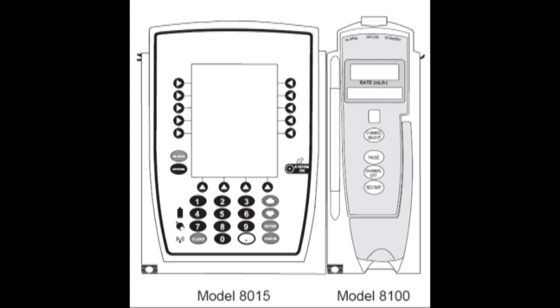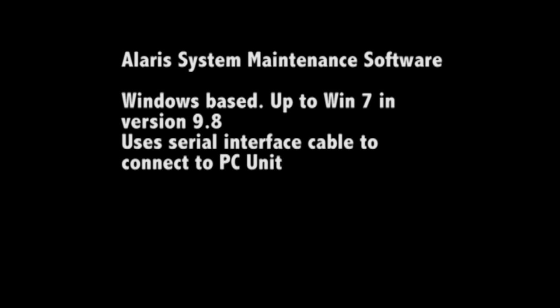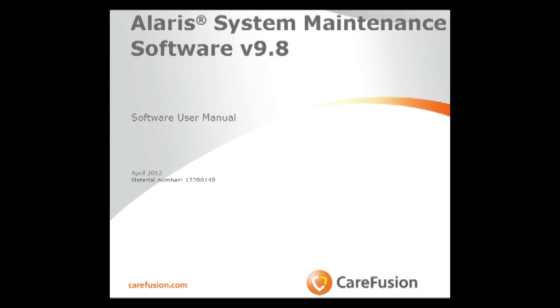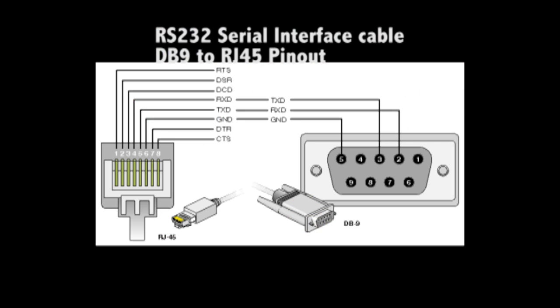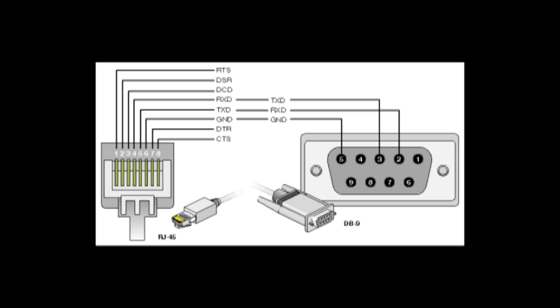So this is the 8015 which is otherwise known as the brain. We use the Alaris system maintenance software to talk to the pump. It is a Windows based product. There is a user manual that accompanies it as well. You will need a serial cable to connect to the device from your PC. And this is the connection at the back of the pump.